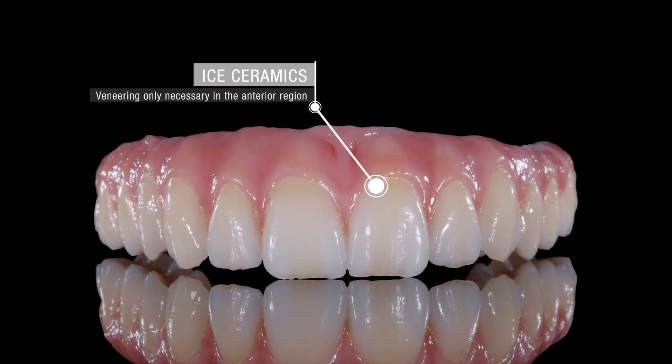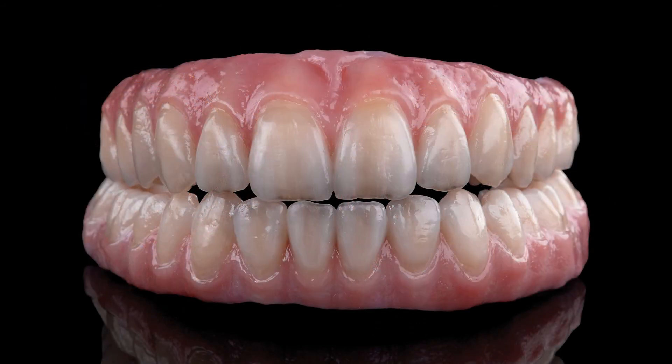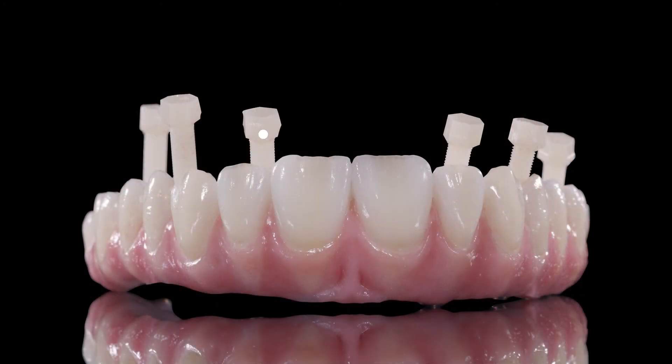After sintering, the fit of the bar in the structure was checked. Pridot 2 zirconia combines extraordinary flexural strength with excellent translucency, so only the anterior region was veneered with ceramic layering before inserting the restoration in the patient's mouth.